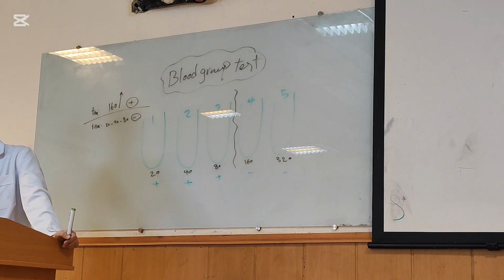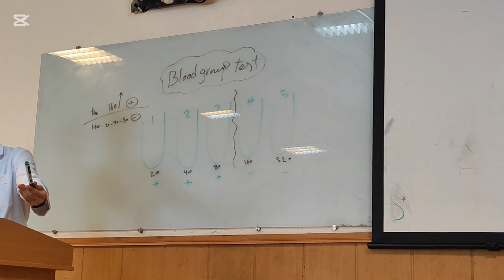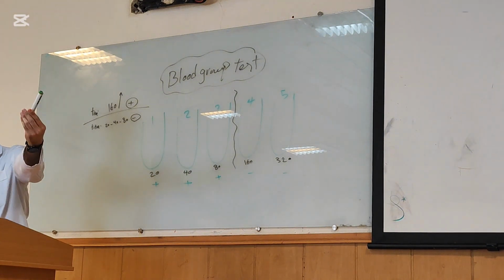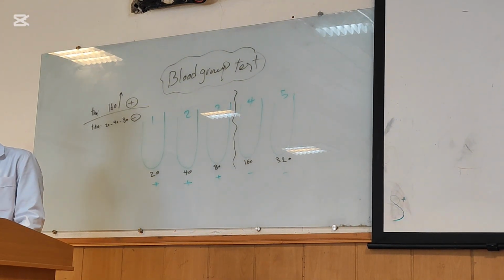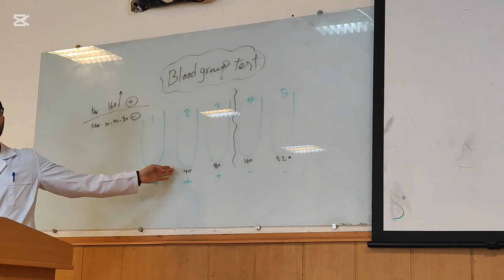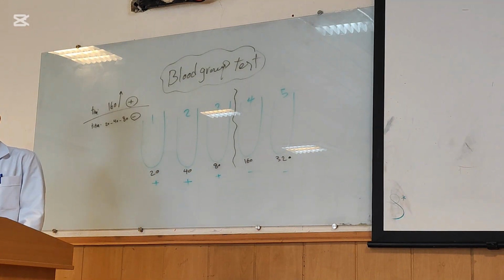I have to correct this for a patient. Do we have to complete it for a patient? But it's correct. If you want to demonstrate a test which shows a healthy patient, this test is correct. Your friend says if we have agglutination in first tube, second tube, and third tube, your patient is healthy. Yes. No, the last one. Yes, that's right.